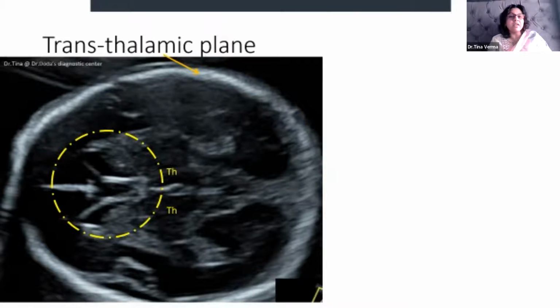So look for the anterior complex, and if you do not find the anterior complex to be normal, or if there is any deviation in the anterior complex, then it might be that we are dealing with non-visualization of the cavum septum pellucidum. So what is the significance of non-visualization of cavum septum pellucidum? This is an indirect marker of absence of corpus callosum, most commonly known as agenesis of corpus callosum. We do an extended neurosonogram, look at the corpus callosum.